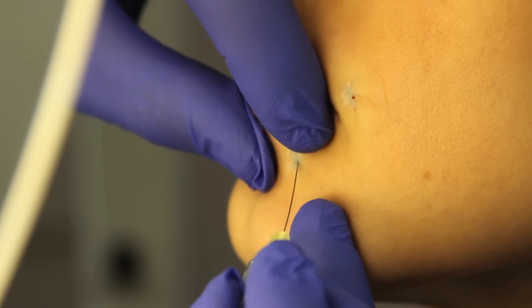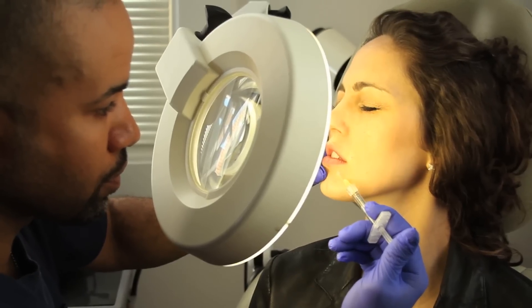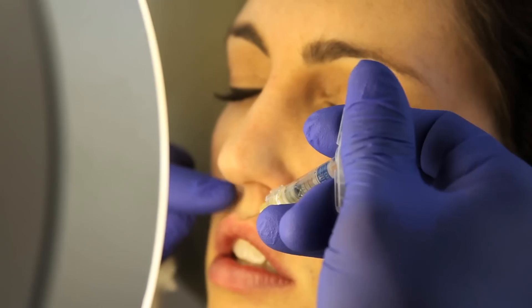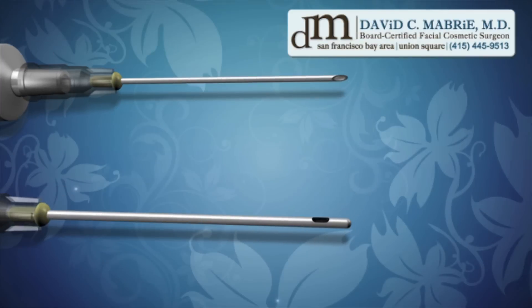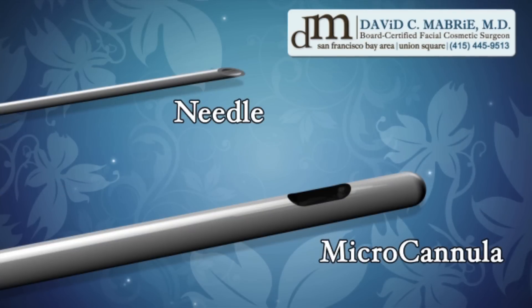I'm going to put the micro cannula on the side. Open your mouth. Because the tip is blunt and not sharp, there's less injury to vessels under the skin.